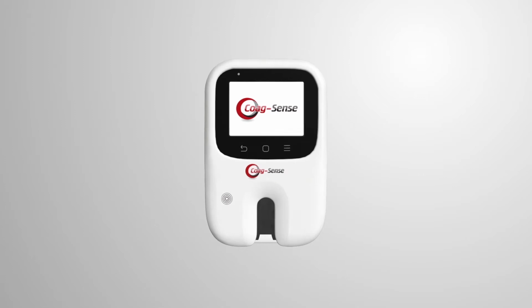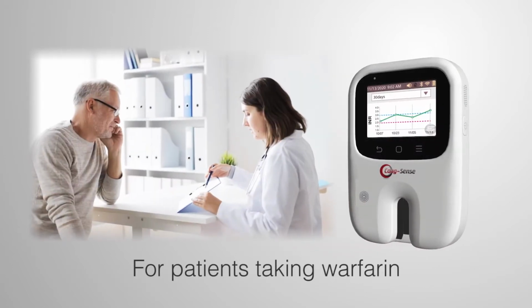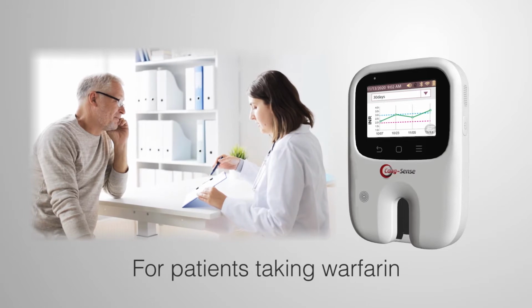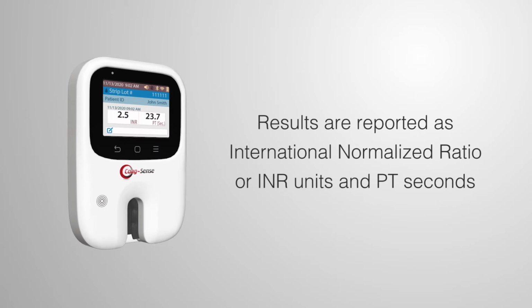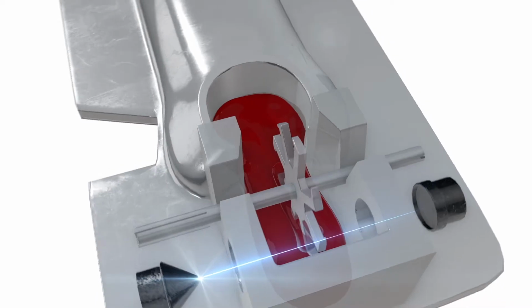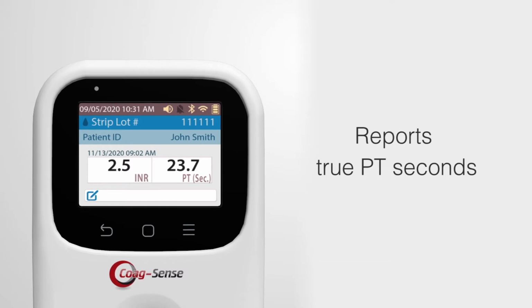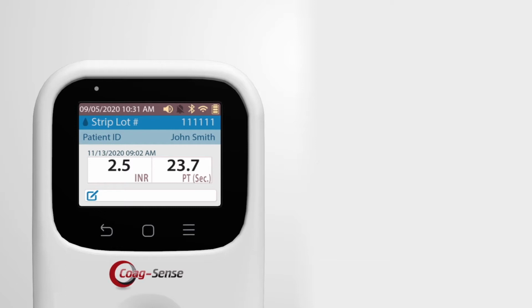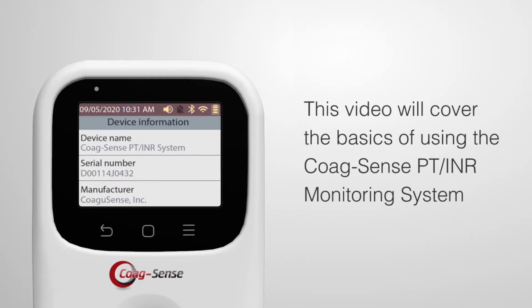Thank you for choosing the Coag-Sense PT-INR monitoring system. The Coag-Sense system is used to test prothrombin time, PT, in patients taking warfarin for oral anticoagulant therapy. Results are reported as International Normalized Ratio, or INR units, and PT seconds. Since the system directly detects the clot formation, it reports true PT seconds, offering lab-quality results from the convenience of your home. This video will cover the basics of using the Coag-Sense PT-INR monitoring system.